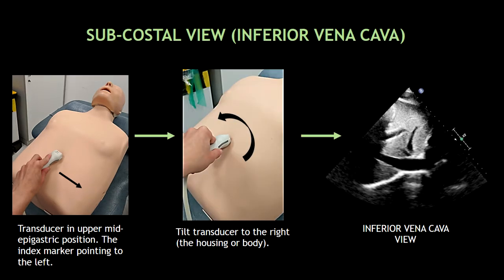Now I'm going to show you how to obtain this subcostal view. This view is concentrating on the inferior vena cava. To obtain this view, place the transducer in upper mid-epigastric position with the index marker pointing to the left. Next, tilt the body of the transducer to the right, and sometimes you will have to ask the patient to take a deep breath in. With these two steps, you're going to be able to visualize the inferior vena cava.